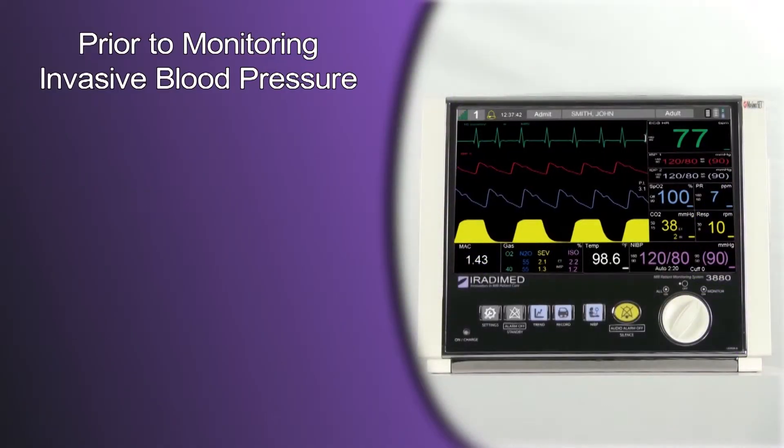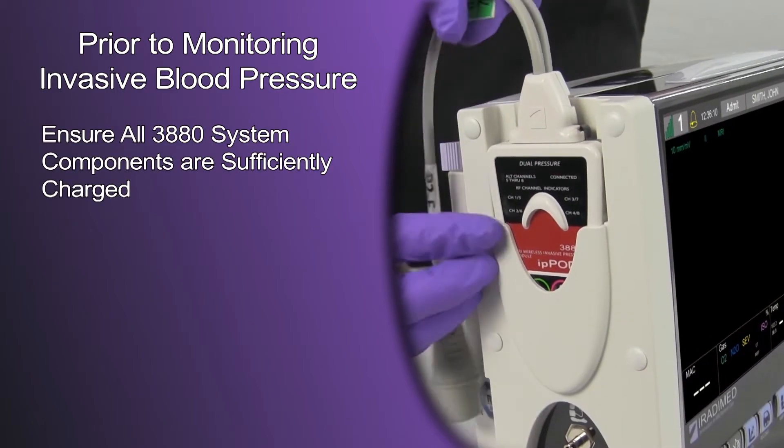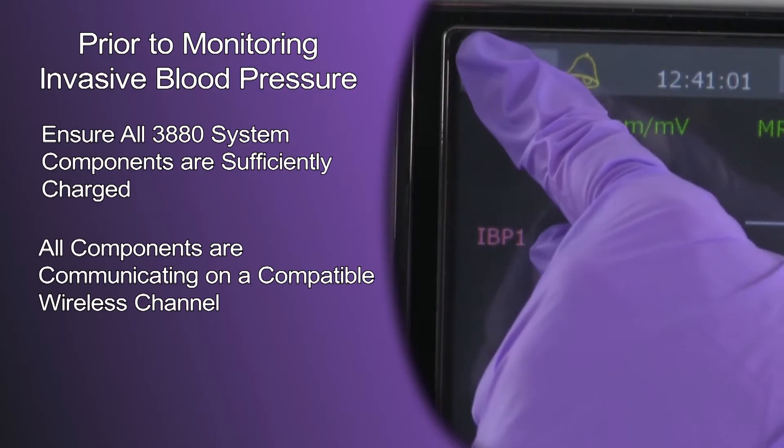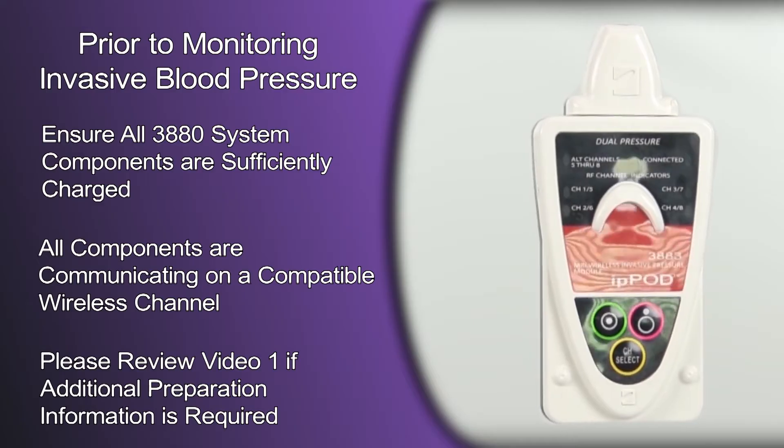Prior to attempting to monitor invasive blood pressure, ensure that all 3880 system components are sufficiently charged and that all components are communicating on a compatible wireless channel. Please review video 1 if additional preparation information is required.